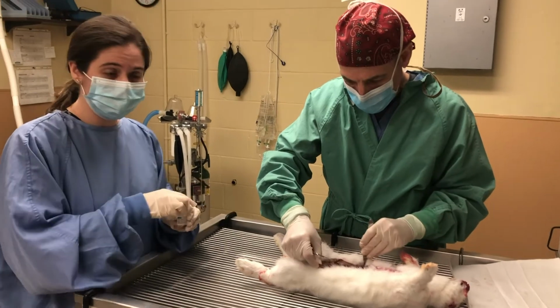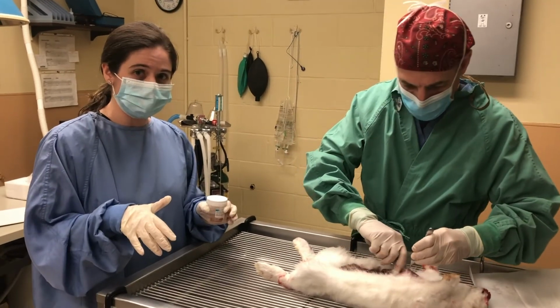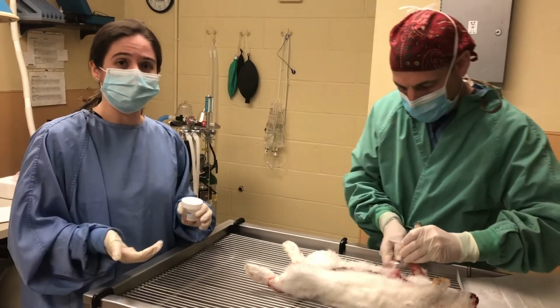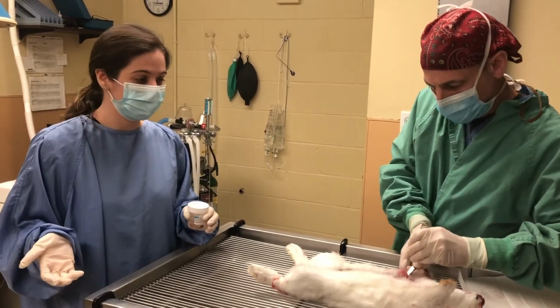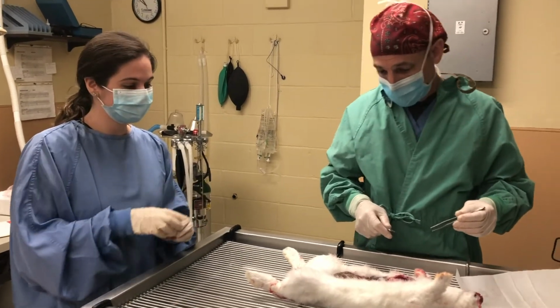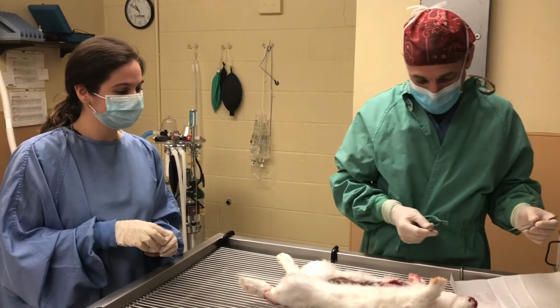Okay, and then once we've gotten all these samples that we need, the doctor will then sew the animal back up, and then it can be processed and sent out for cremation. All right. Otherwise, this one looks okay, besides it unfortunately being deceased.